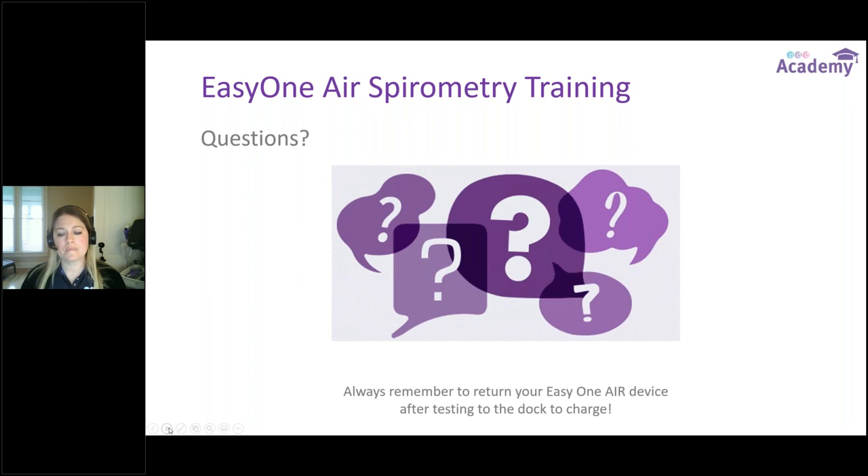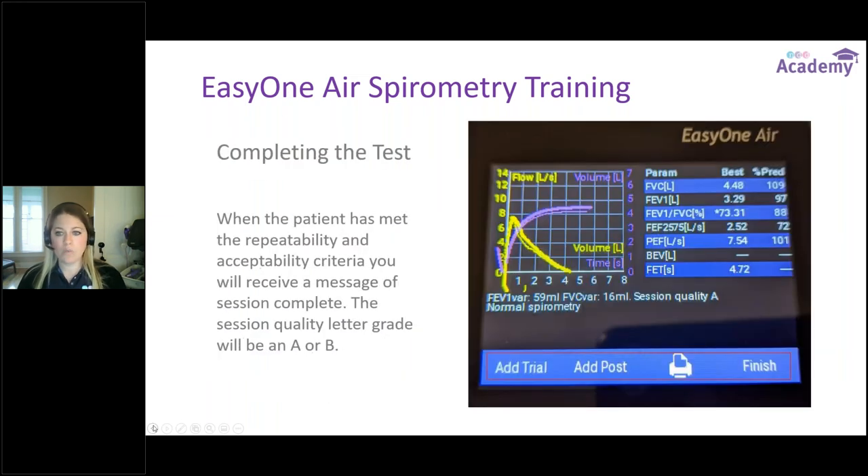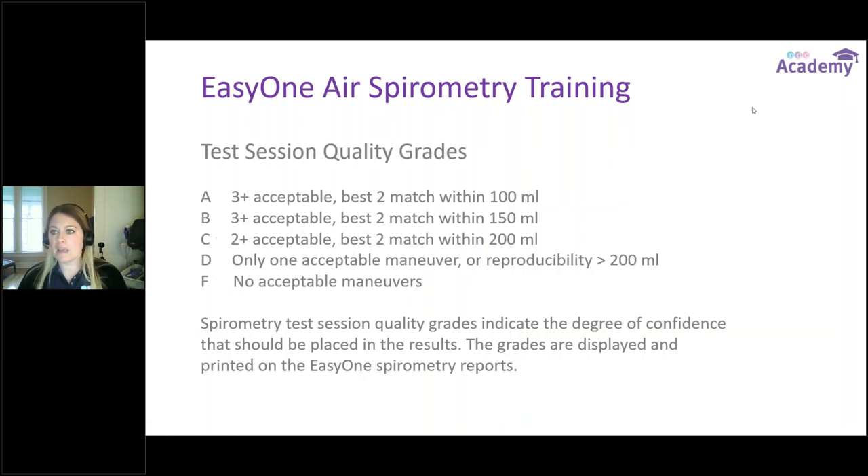Question: how do you delete an unacceptable maneuver during the test? You can get to the results screen before you complete a session. On the coaching bar between trials there are two options: Add Trial or View Data. Between each trial you can choose to view the data — on the device screen between trials there is a small trash can icon, so you can delete a trial while testing. Once you've finished the test, you cannot go back in and edit. Deletion needs to be done trial by trial.